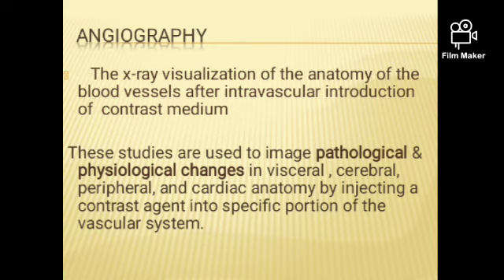So again, what is actually angiography? It is the study of the intravascular structures. Our blood vessels are structures in the category of soft tissue, and soft tissue doesn't highlight very clearly when you are seeing with X-ray. That is why we are going to inject a foreign body. What is the foreign body? That is nothing but our contrast media.